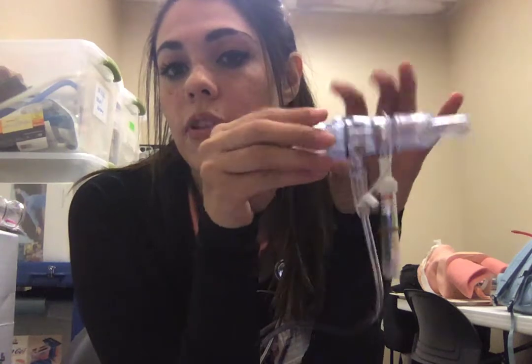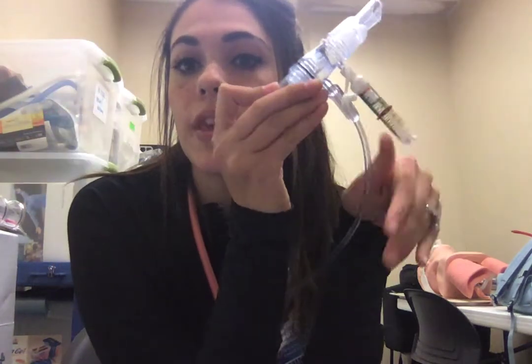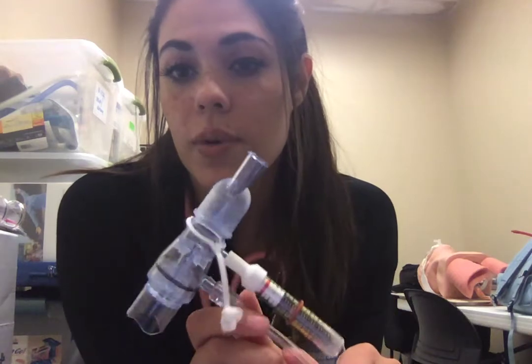Contraindications: the biggest one is flail chest. If a patient has flail chest, we're not going to use this. And one thing this poses a danger in is hypoventilation. Any patient that comes in with hypoventilation or respiratory acidosis, we're not going to use this device.